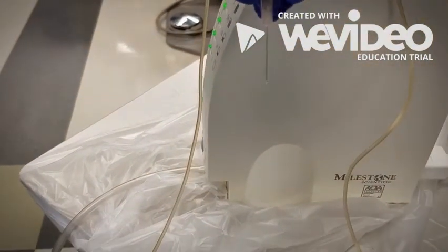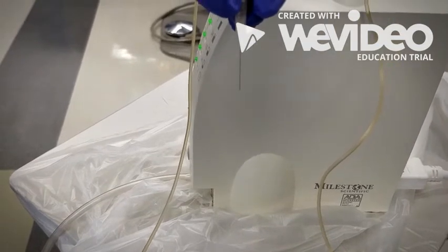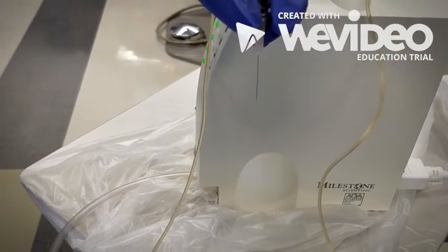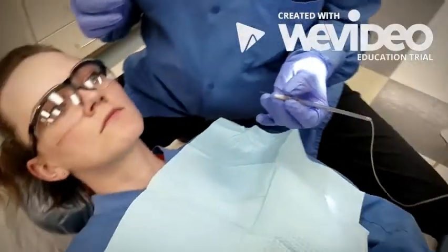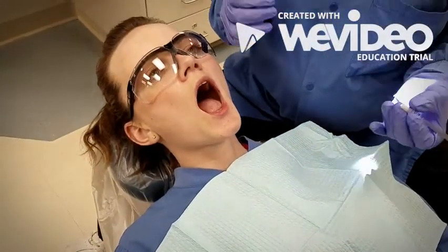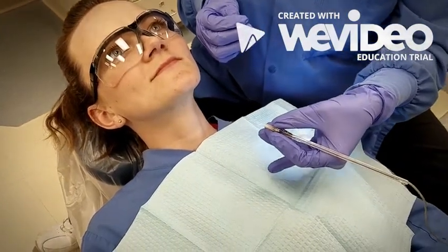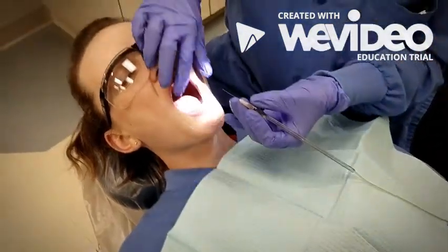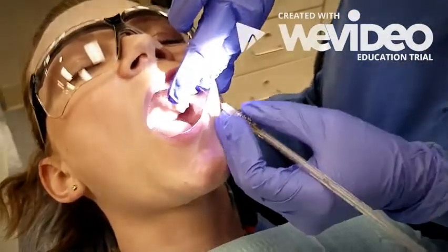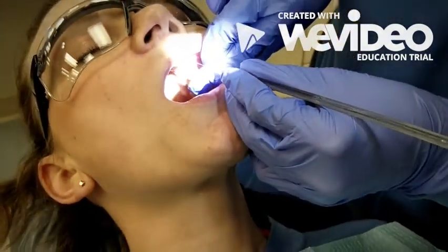You can see the solution suck back up, indicating that aspiration is working. And finally, the path of insertion is different. We are used to a linear insertion with a traditional syringe. While pushing through tissues in this manner, the needle can become deflected, altering the terminal deposition site. With the wand, we implement a birotational insertion between the thumb and index finger to overcome this needle deflection.